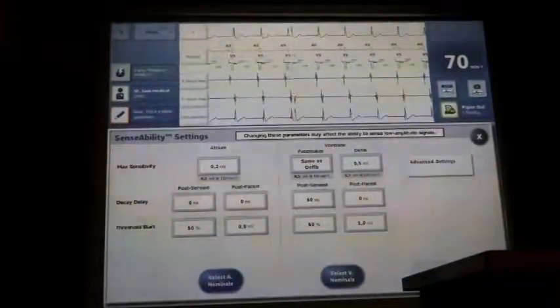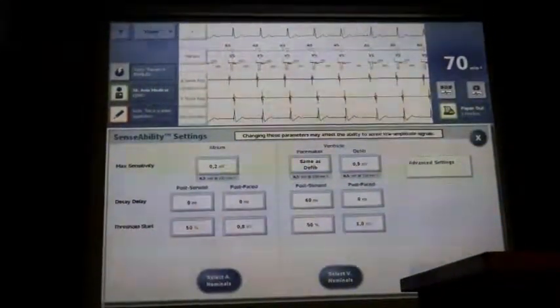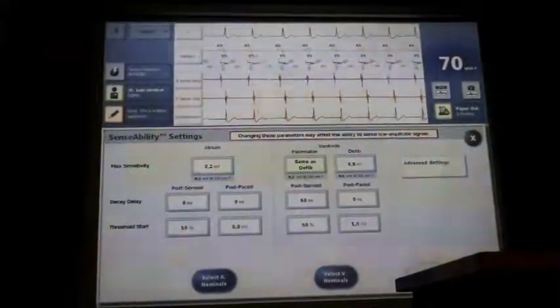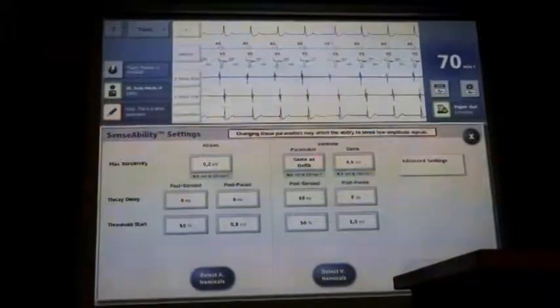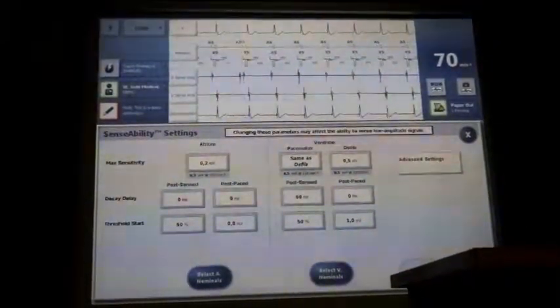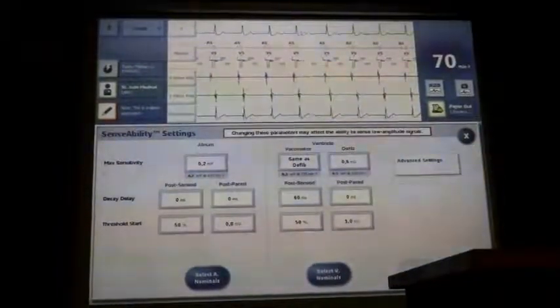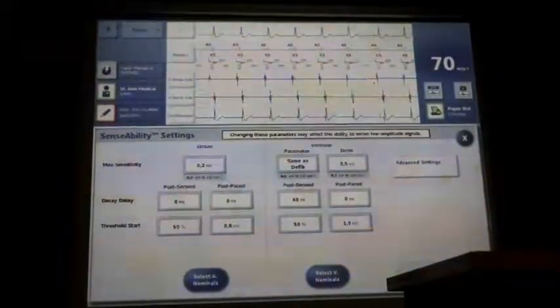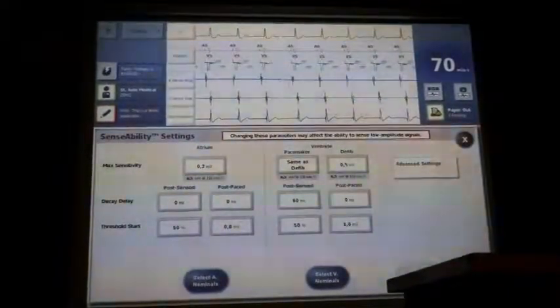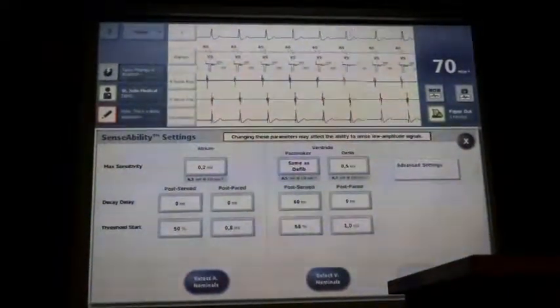What we do sometimes see, I did say earlier, there is no T-wave sensing on Abbott devices when it's sensing. Virtually none with new devices. I haven't seen it. You will see it occasionally when you pace. So you will see T-wave occasionally when you are ventricularly pacing. It never results in inappropriate shock. We'll see why in a minute.